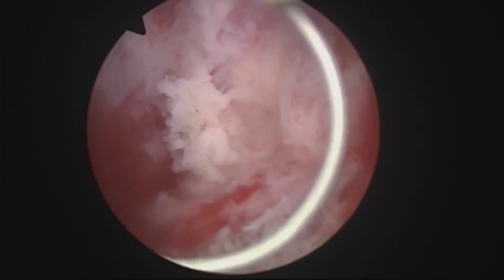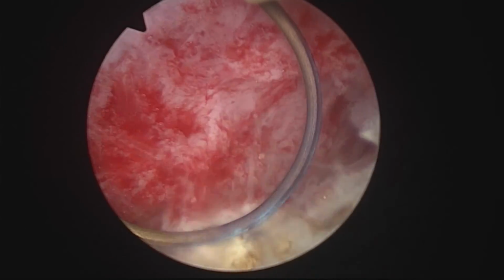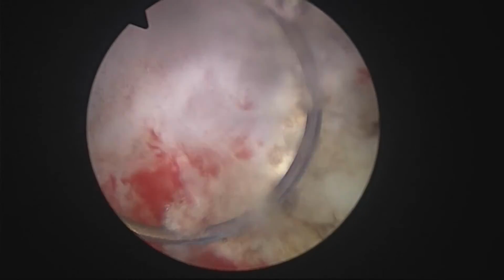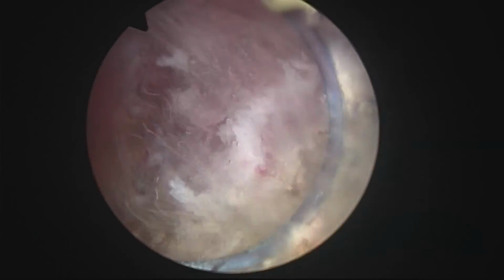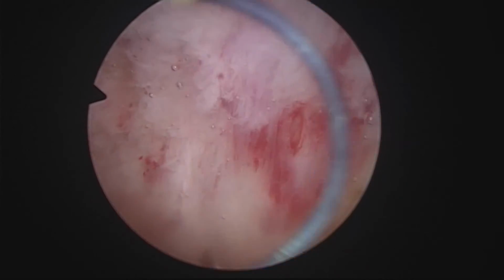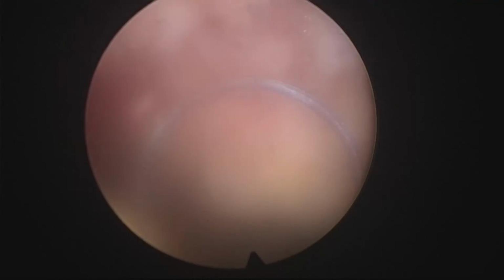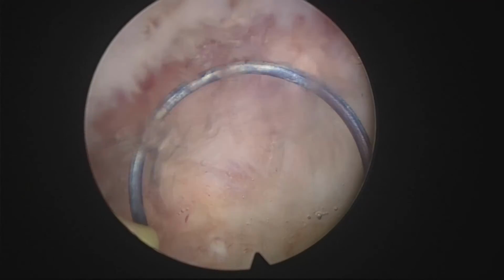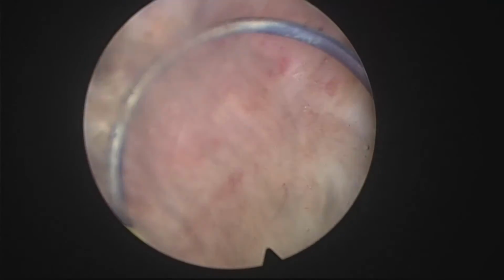You see, also, of course, this tissue probably is more inflammatory than usual, and more prone to bleeding a little bit. So I thought, let's spend 2 minutes perfecting hemostasis in the fossa, and then I will go to the diverticulum. Many times I think these bleeders, for some reason, when we put a catheter and the prostatic capsule collapses, they tend to stop. And it is the distension of the fossa that keeps them bleeding. That's the venous bleeding. If there are small arteries, of course, it's a different matter.